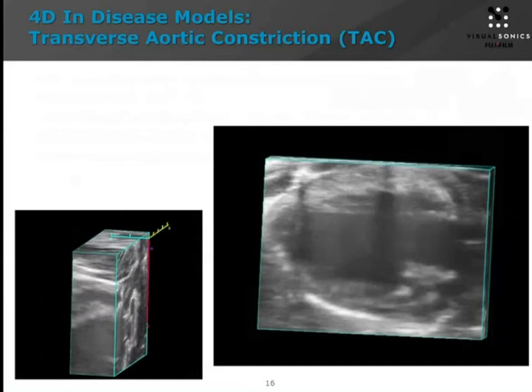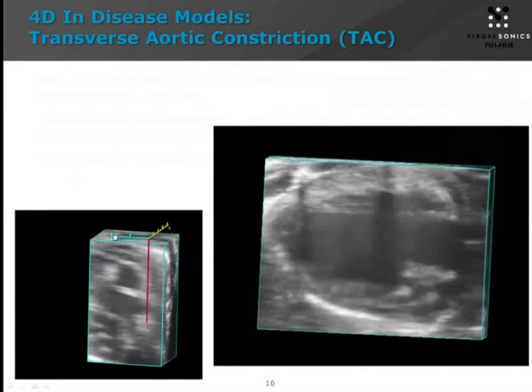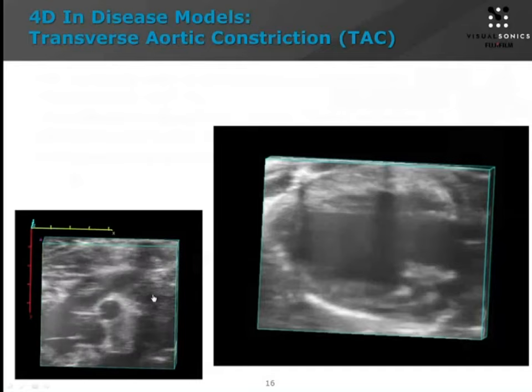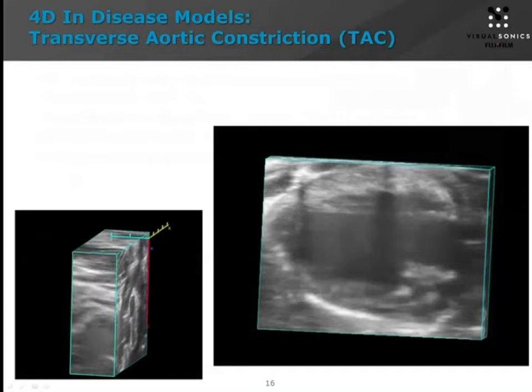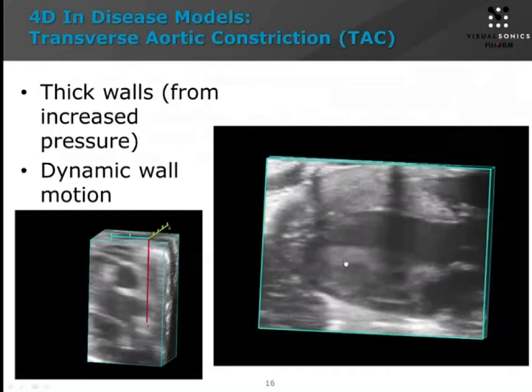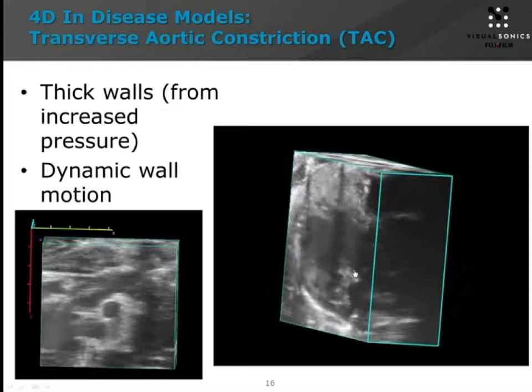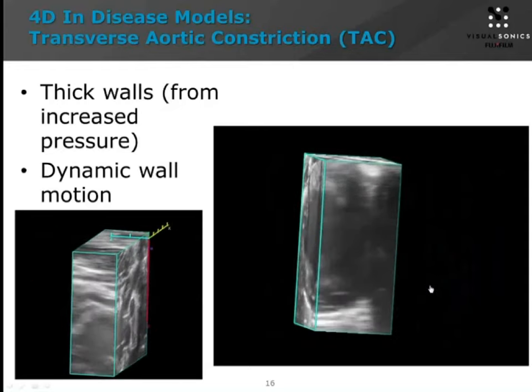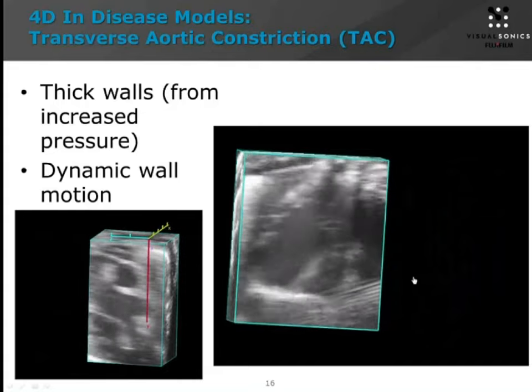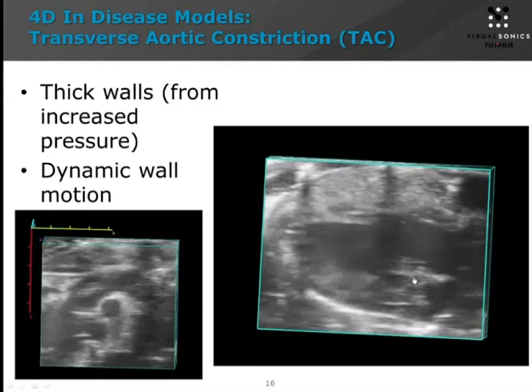You can see on the bottom left a 4D image of the aortic arch. When we look at it, we can actually see that banding happening right at the aorta. What's even more interesting is when we look at the left ventricle on the right-hand side — we see thickened walls of the left ventricle in long axis. When we move over and scroll through a short axis view, you can really appreciate the thickness of the walls in short axis as well. You'll also notice that although the walls are thickened, the heart's movement is still very dynamic, which will be a bit different in the next model.